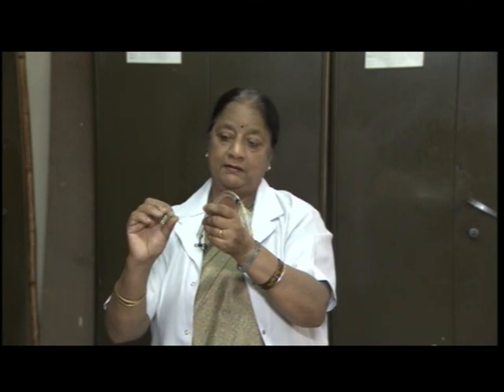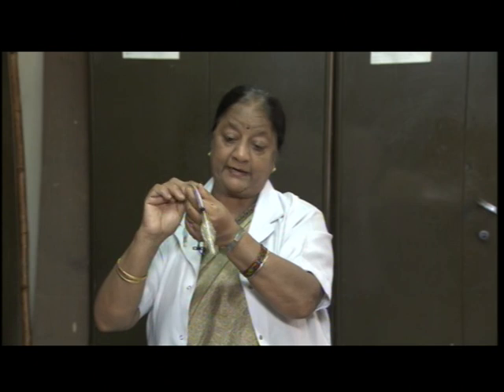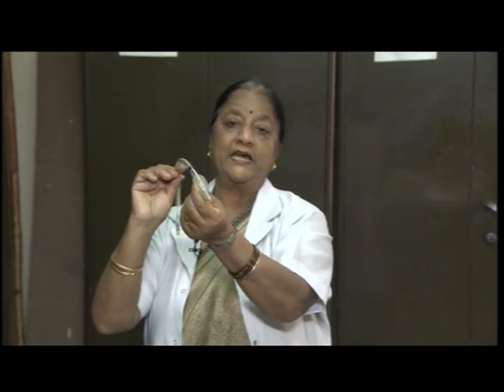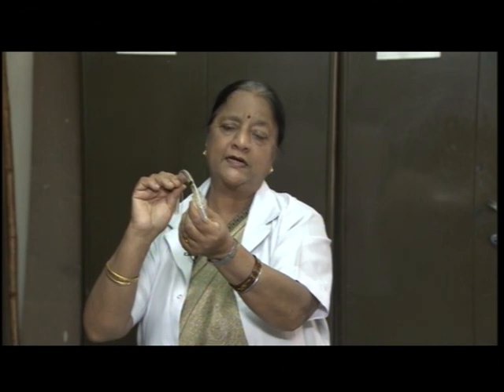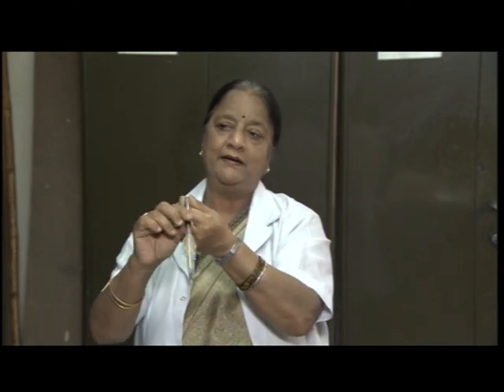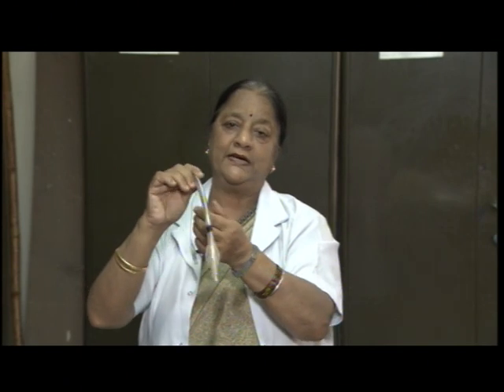When we introduce air from here, after introducing into the trachea, this gets inflated. The main purpose is so that it does not come out. It fits snugly there. So, this goes into the trachea and then is attached either to the ventilator or to the oxygen source.